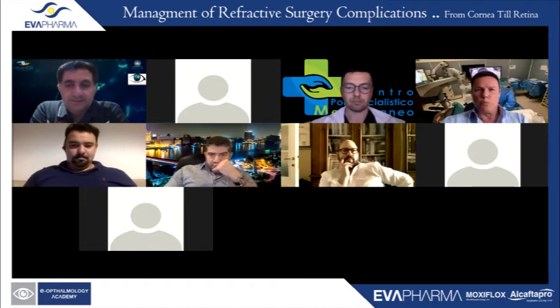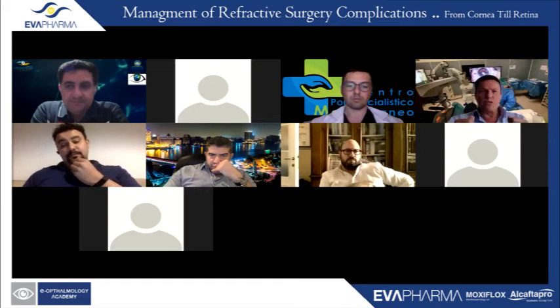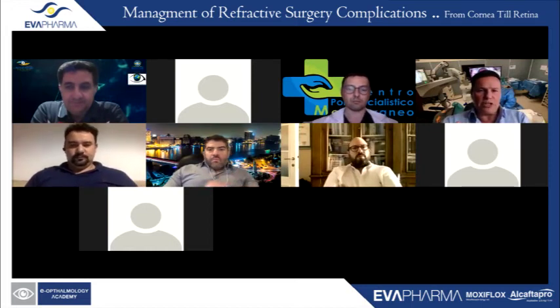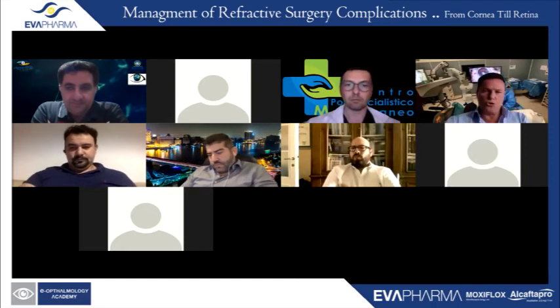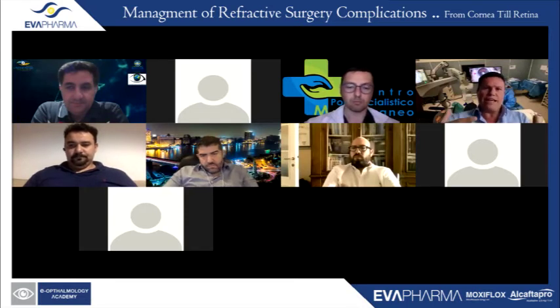I always do a cycloplegic refraction when they're very young, and then I get them back in the office approximately a week later, and I try to push them as much into the hyperopia as possible to get the maximum out of my ICL implantation, but not overcorrect, because when they end up in myopia, they're not happy either. So you have to talk a lot more to hyperopes and tell them, we will have a latent hyperopia.